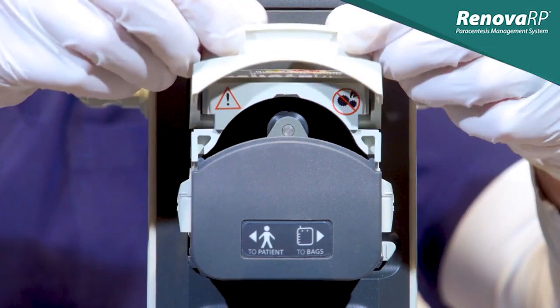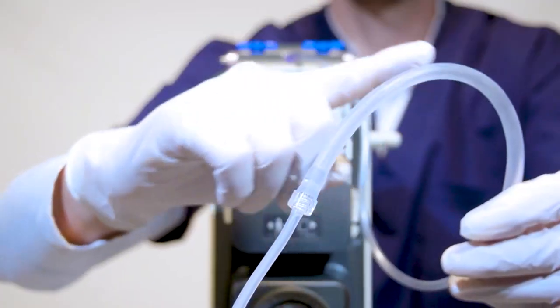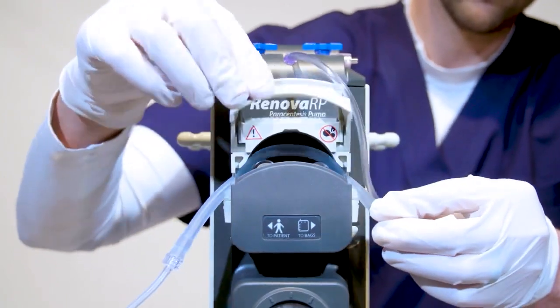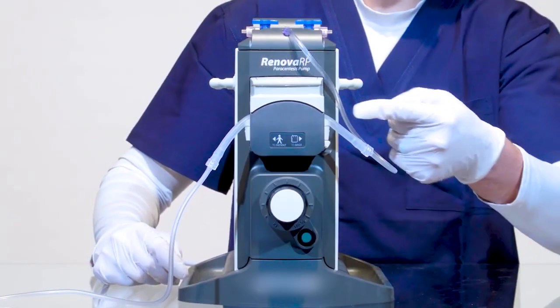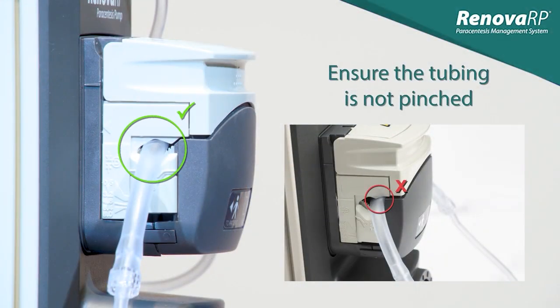When we lift the flip top of the pump head, we're able to see the rollers which are responsible for moving the fluid along as they contact the tubing. The thicker part of the tubing is designed specifically for this purpose. Center the thicker portion of the tubing over the rollers and close the flip top. At this point, ensure that the tubing has not been pinched on either side by the flip top. Double check this before moving on.